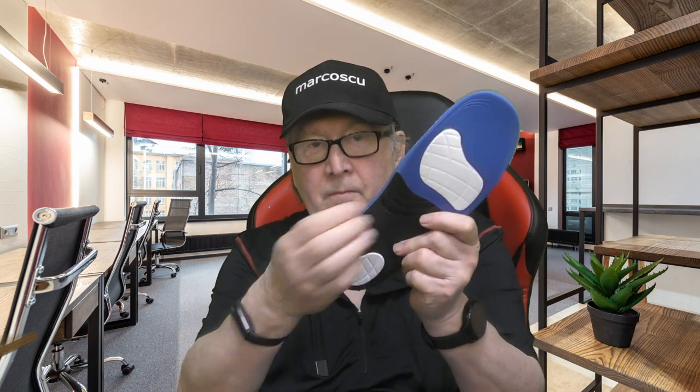I thought these would be the same as other padded insoles I've tried, but no — these ones are made for people suffering from plantar fasciitis, flat feet, or other related foot issues. They're designed to give physical support under the arch of the foot. The main part of the insole is made from a standard padded foam material, but the section under the arch is made from a semi-rigid silicone-like material that gives proper shape support to that part of the foot.